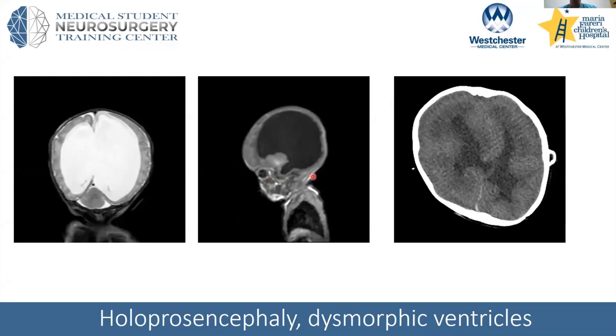This is on a continuum, and this is just an example of some dysmorphic ventricles — they look very abnormal. You can tell this patient has a shunt; you can see the valve here on the side.